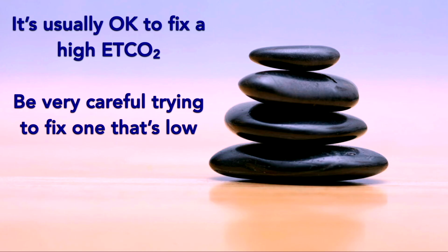And probably one of the most important things to know about use of end tidal CO2 is it's usually okay to fix a high end tidal CO2. But you have to be very careful trying to fix one that's low, because there's a good chance that you may end up hurting the person doing that.